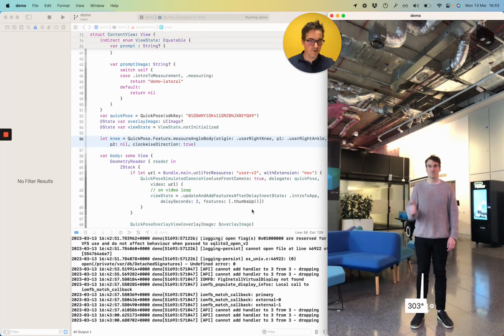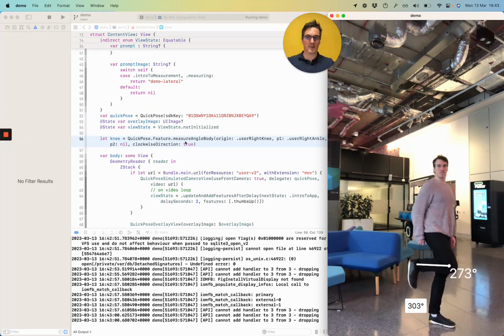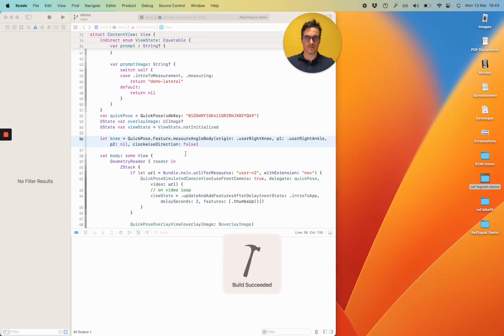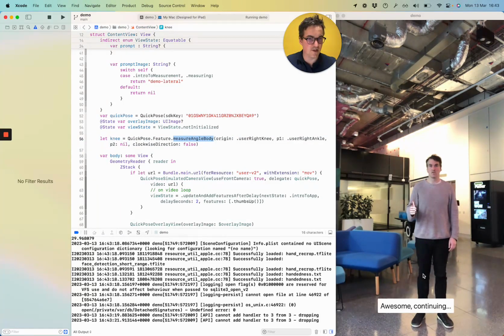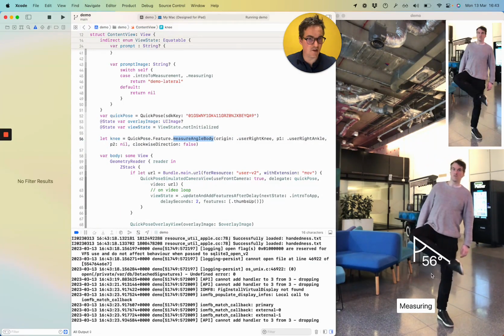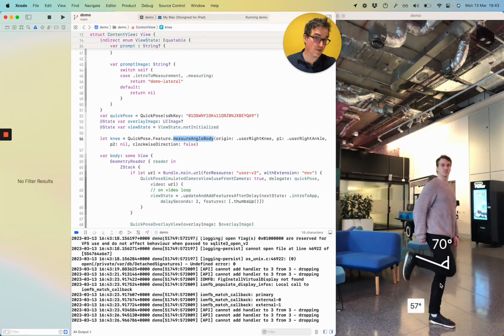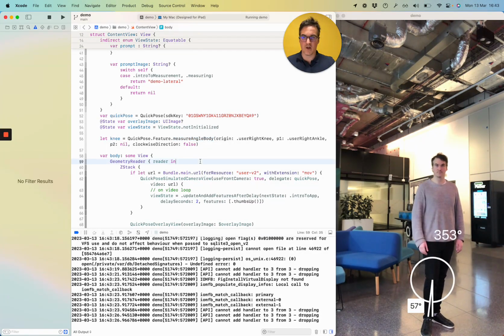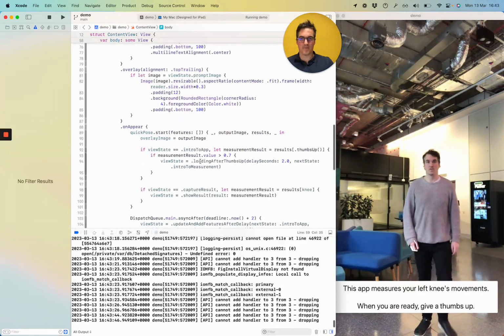Right, I have put the wrong direction in because you can see here I wanted it when it raised up to the left. So here we can see a custom measurement angle with the origin of my knee and my right ankle being the correct pivot and it being a counterclockwise direction, anti-clockwise. And the measurement there was 57, looks valid. The video is going on to do the other measurements, so I'm just going to ignore what it's showing for now. Okay, so we've got our result there. So I'm pretty happy with that.